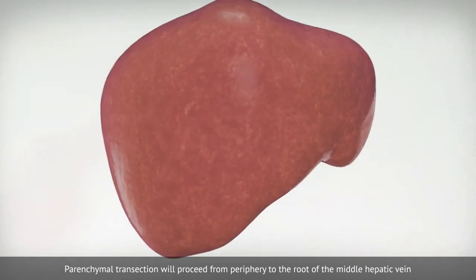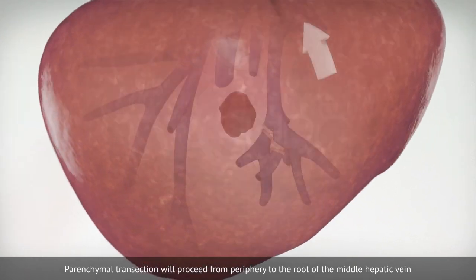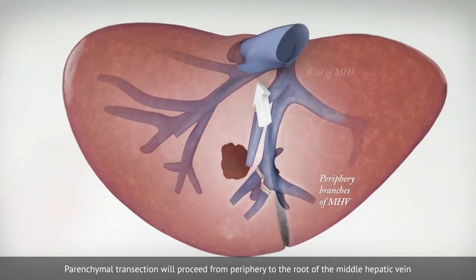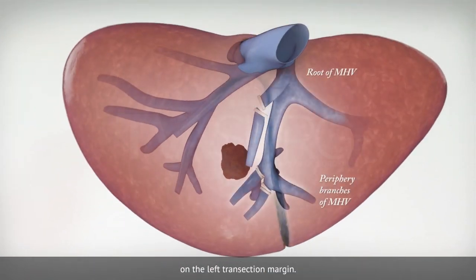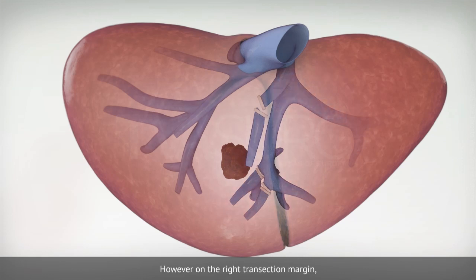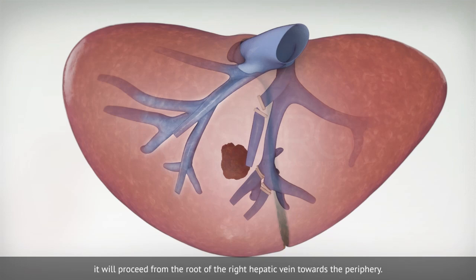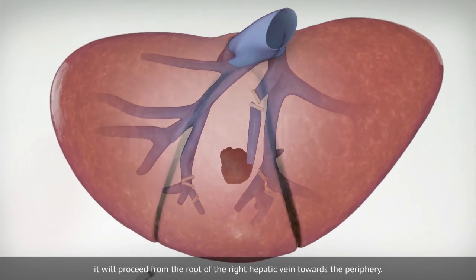The parenchymal transection will proceed from periphery to the root of the middle hepatic vein on the left transection margin. However, on the right transection margin, it will proceed from the root of the right hepatic vein towards the periphery.